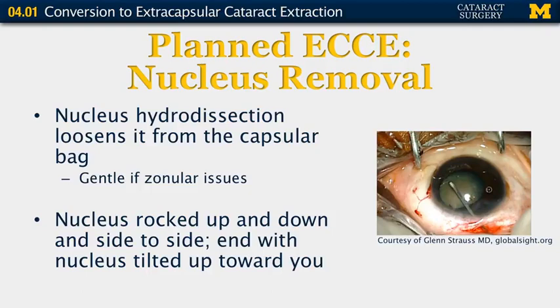Next we proceed with nucleus removal. We perform hydrodissection just as you would with phacoemulsification, which loosens the nucleus from the capsular bag. If there are any zonular concerns, especially with a very dense cataract, be somewhat gentle with this portion. The nucleus is then rocked up and down — take your cystotome, embed it into the nucleus, and rock it up and down to ensure it's loose and beginning to prolapse from the bag. Then rock it from side to side and push down so the nucleus is tilted up towards you at the wound.